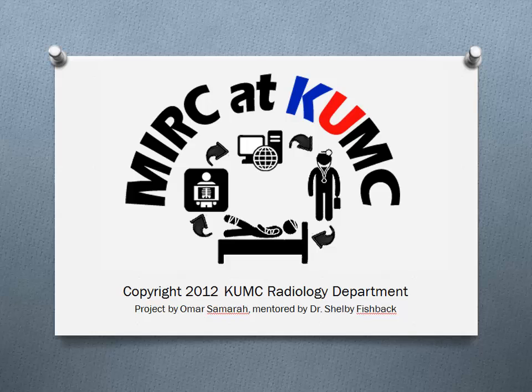The next step is the tutorial on HIPAA, PHI, and anonymizing.